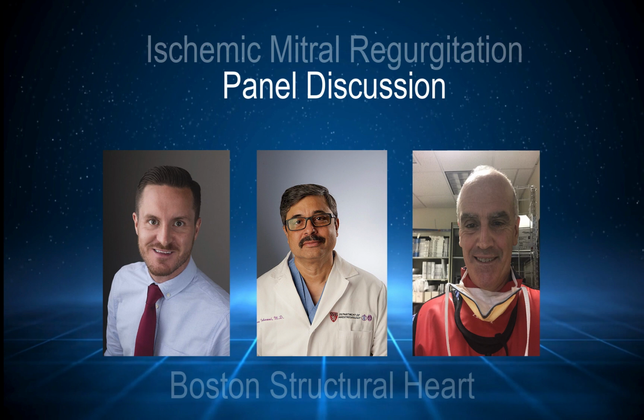And I guess it depends on how big the annuloplasty is and how amenable everything is to do a percutaneous valve and ring case. And the valve and ring case depends on what ring you want put in. Is it a circular ring? Are you going to have paravalvular leaks after you put it in? There seems to be a lot of questions that are unknowns with this in the future. It would just seem a lot easier just to replace the valve now. It's just a lot easier to replace the valve.